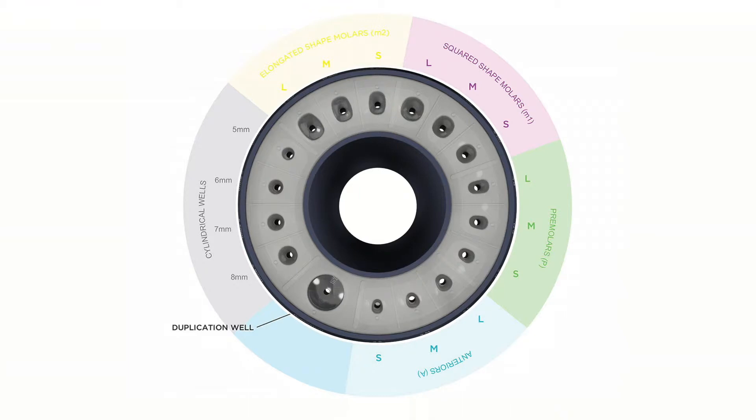The duplication well can be used to duplicate a custom healing abutment where its subgingival portion has been modified intra-orally, or also to duplicate the submerged area of a temporary prosthesis to a duplicate impression post.